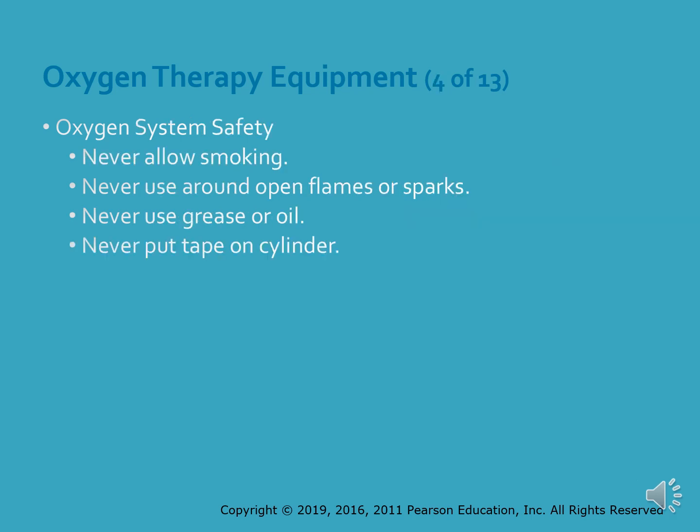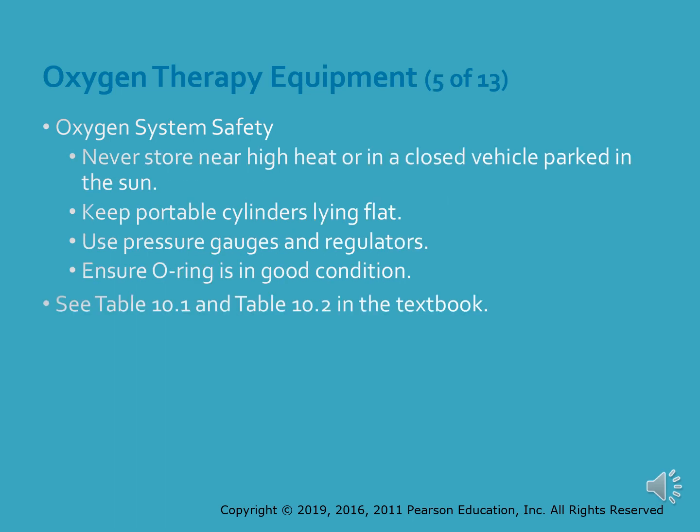While all oxygen systems are designed with safety in mind, there are several tips that you should be aware of when working with them. The following are some general guidelines to keep in mind when working with high pressure cylinders. Never allow smoking. Never use around open flames or sparks. Never use grease or oil, and never put tape on the cylinder. Never store near high heat or in a closed vehicle parked in the sun.